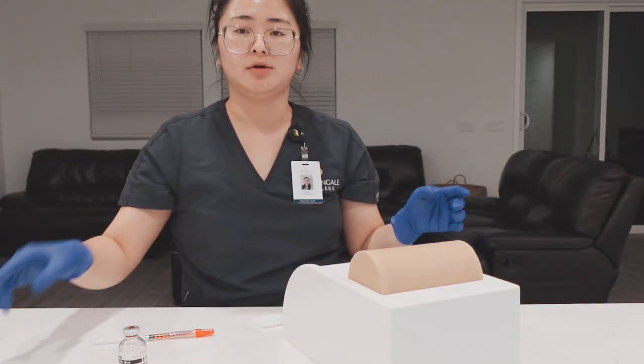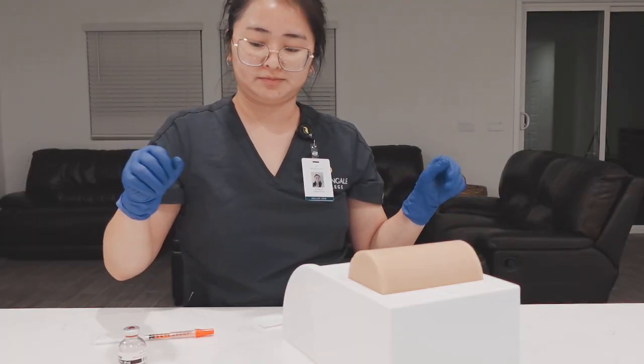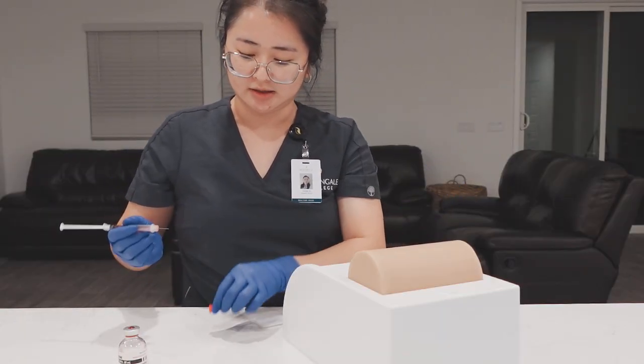We're going to let that dry. We're not going to blow on it. We're not going to fan it at all. It is fine. So we're waiting for it to dry. It's perfectly fine. Great. So now I'm going to uncap this.